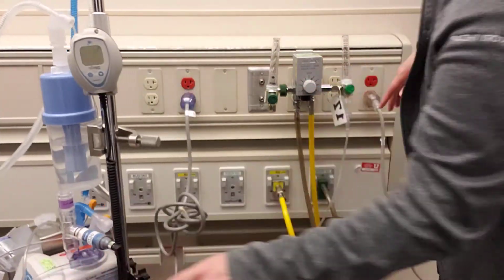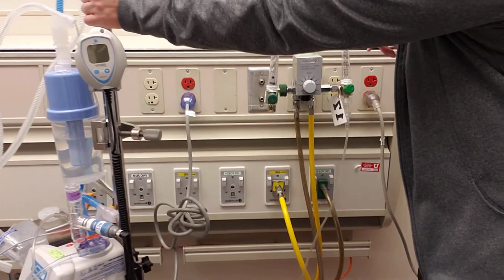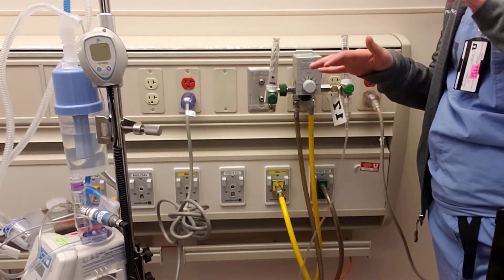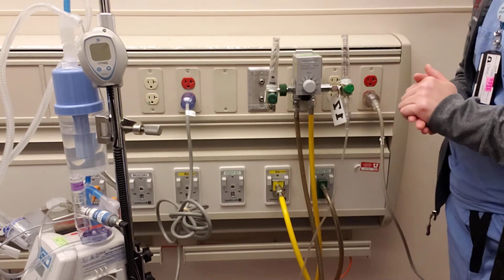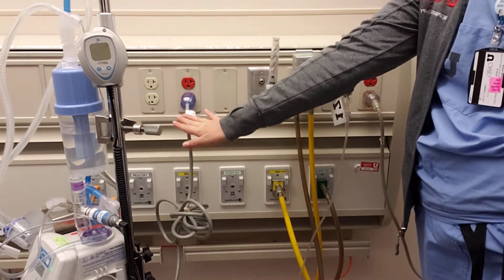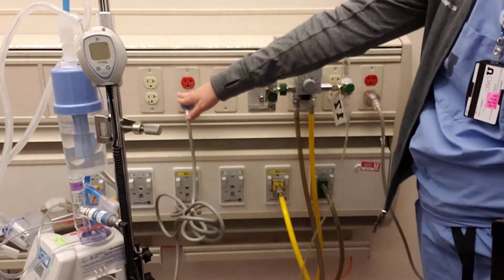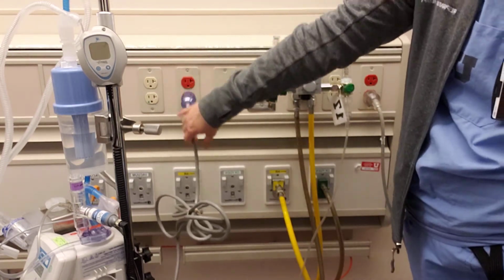So moving to the back, just as with all respiratory equipment, ventilators, any major piece of equipment, we are electronically and pneumatically run. This is hooked up to our heater and plugged into the red socket.